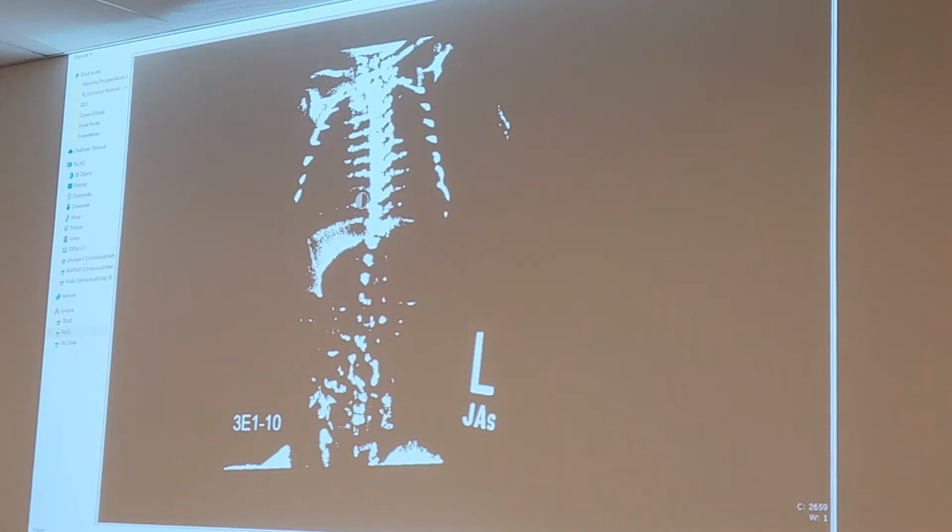I've only got black and white. I can only see like bones and air. Do you see? So this is high contrast, but low contrast resolution. For example, can I see the heart? No. Can I see the liver? Can I see the stomach? It all just blended together with the air, or the rest of the organs. So low contrast resolution. I can't tell those individual organs apart.